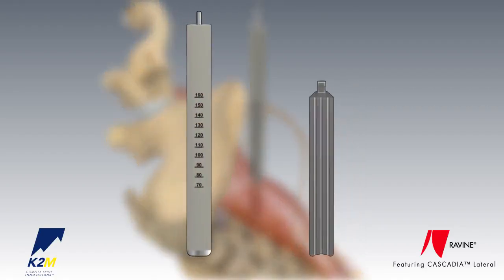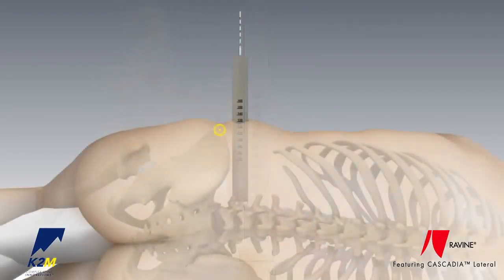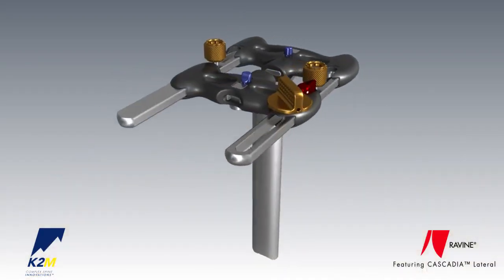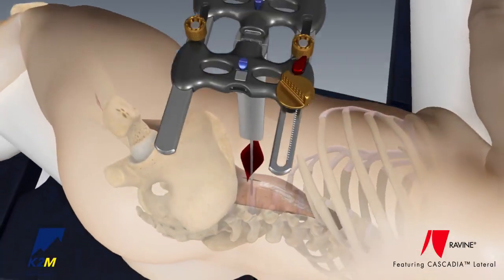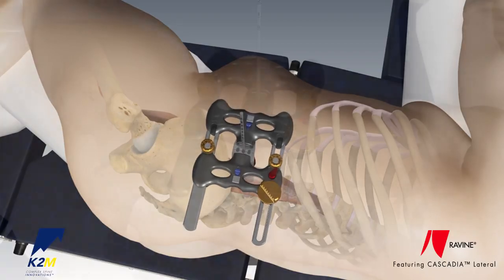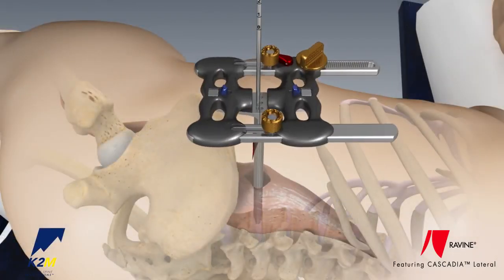The largest dissector should match the width of the Ravine Lateral Access retractor blade. Blade length is determined by any one of the dissectors in relation to the skin level. Once the Ravine Lateral Access retractor is assembled with the appropriate sized blades, the dissector is removed. The retractor is introduced into the same safe corridor by capturing the guide wire in one of the desired blade channels. The Ravine Lateral Access retractor is then rotated 90 degrees so the orientation of the blades is in line with the end plates.